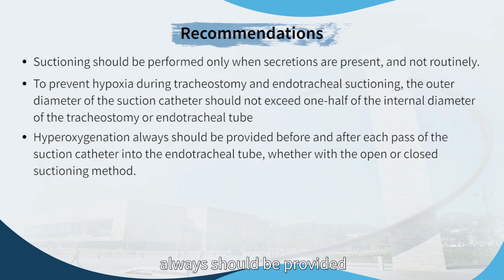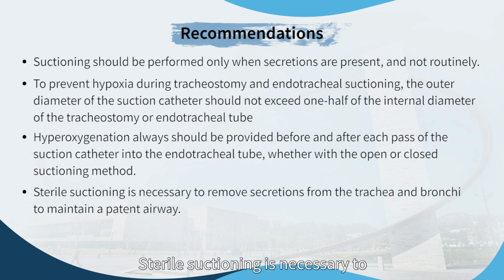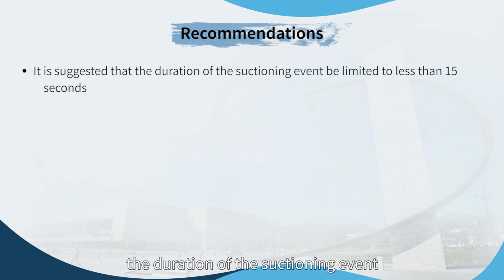Hyperoxygenation always should be done before and after each pass of the suction catheter into the endotracheal tube, whether with the open or closed suctioning method. Sterile suctioning is necessary to remove secretions from the trachea and bronchi to maintain a patent airway. It is suggested that the duration of the suctioning event should be limited to less than 15 seconds.